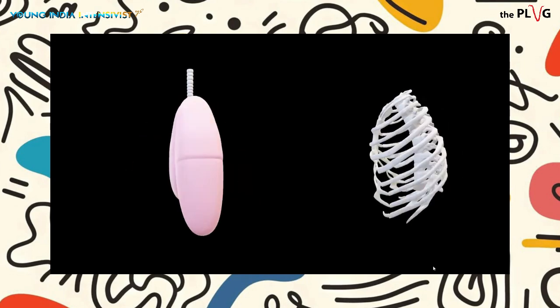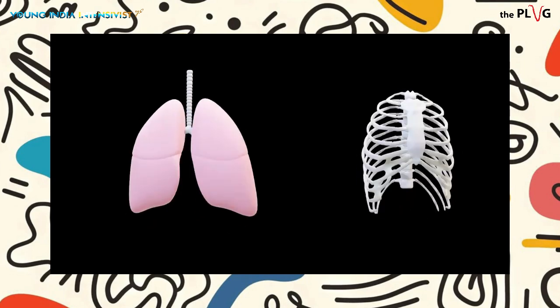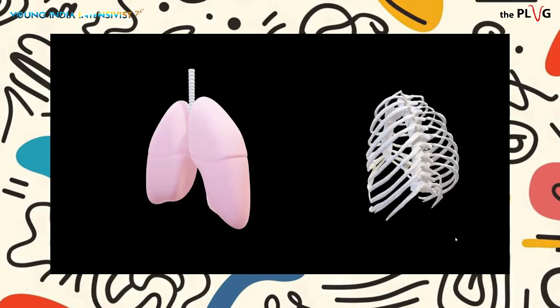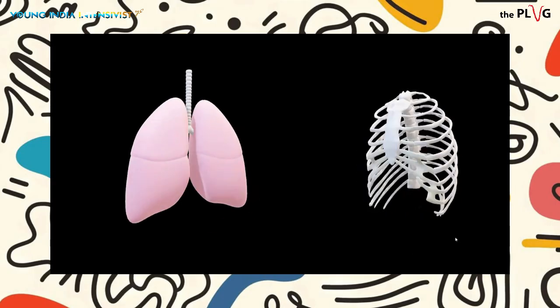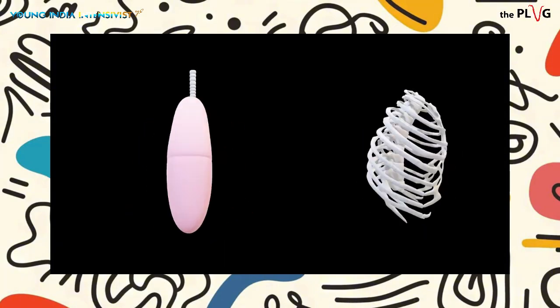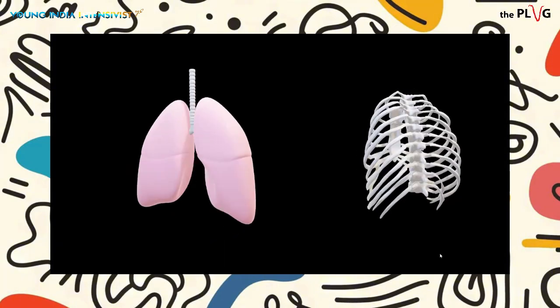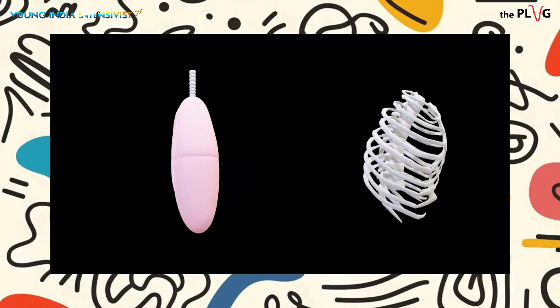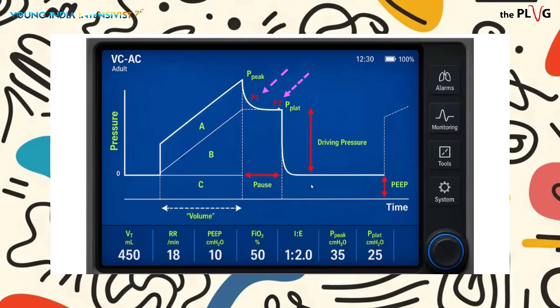This is the lung and the respiratory wall, which is moving in opposite directions because the lungs and the respiratory wall are not attached in parallel, they are attached in series. If we think of the circuits that we have in electricity, that is the way the mechanics are. And here is the assist volume control screen, which is common to all of you. And this is a pressure scalar.